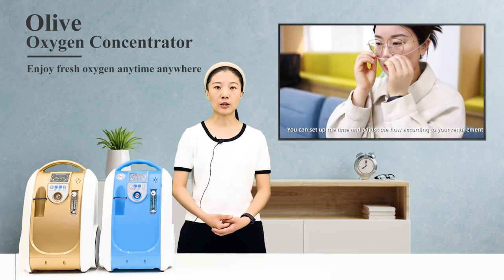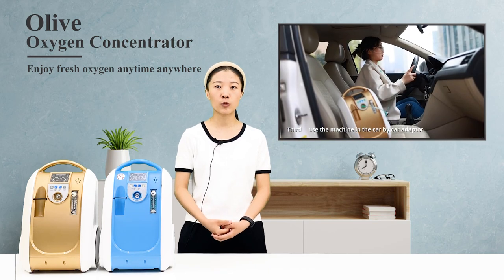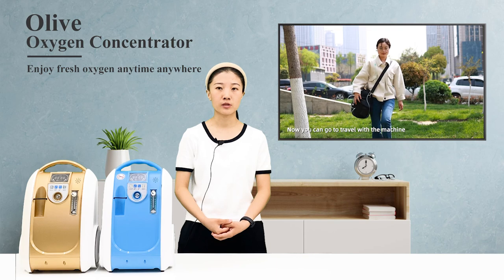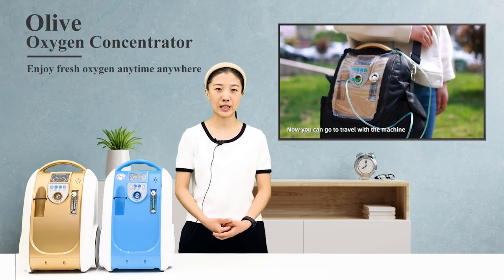You can use it at home, or connect it to the inverter in the car together with a cart or backpack for outdoor use, to meet your needs for fresh oxygen anytime and anywhere.